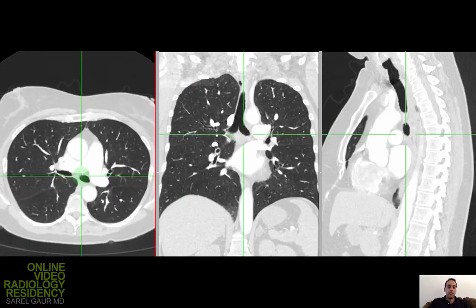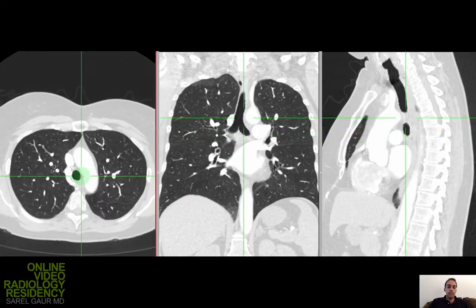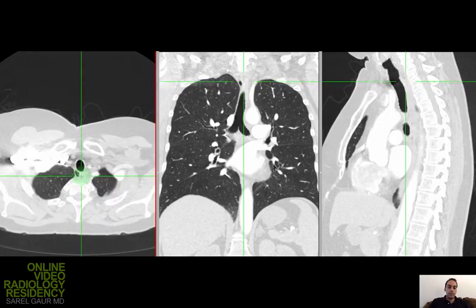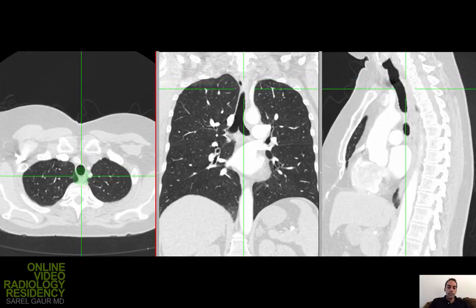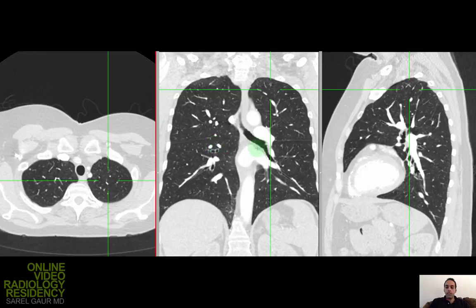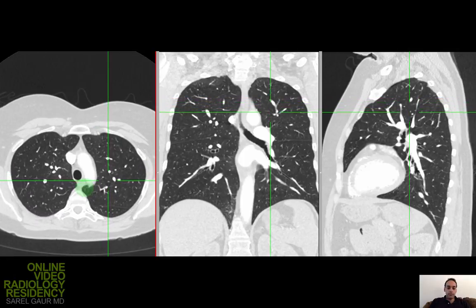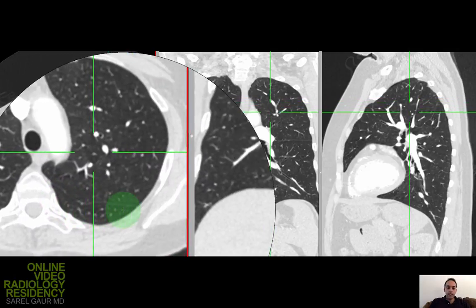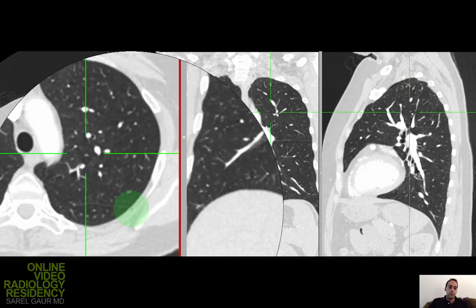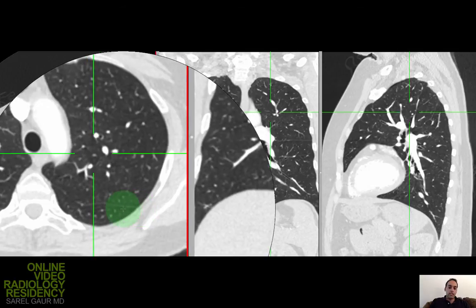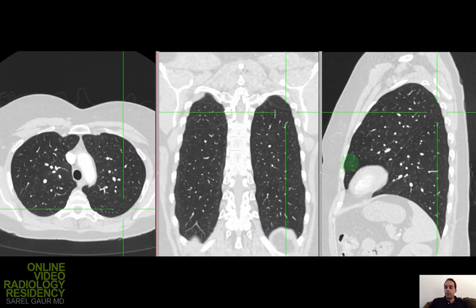That covers the right lung. Let's move back up and do the left lung. As I'm coming down, you can see the left upper lobe — you can see that in the coronals above the left major fissure. Continuing down on the axials, you see this radio-dense line, which is the coaptation of two pleural surfaces, and that is the left major fissure.